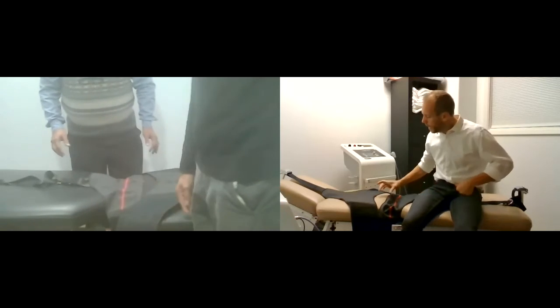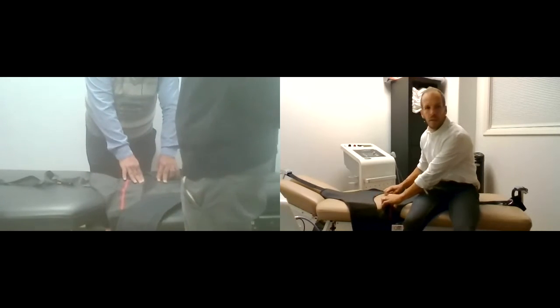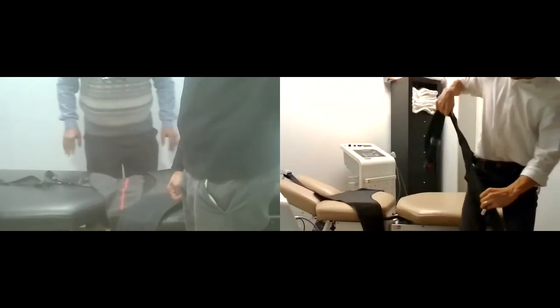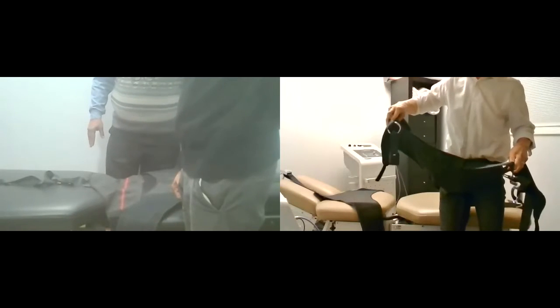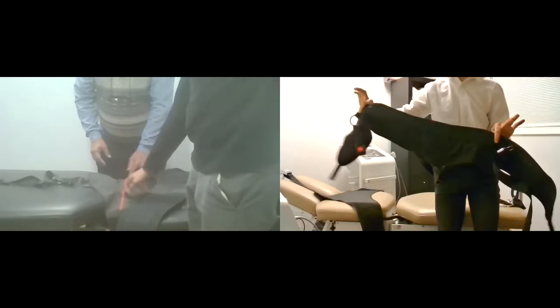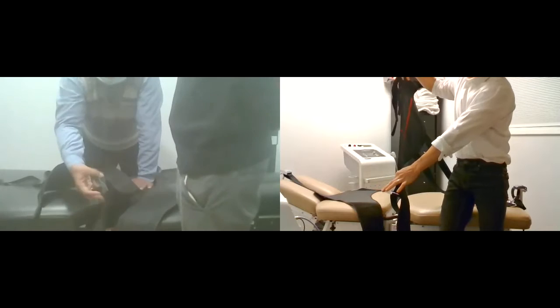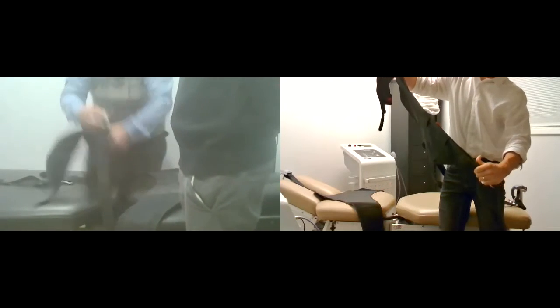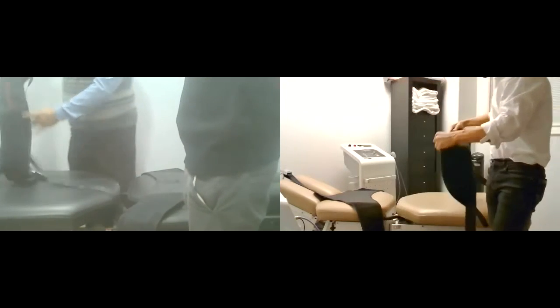So now we've got about a 2-inch gap here. Before he gets on the table, what you want to do is grab this harness and grab one seatbelt in each hand, so one seatbelt here, one seatbelt here. It's going to be nice and spread out. Grab it like this, one in each hand. Grab your whole harness like this. There you go.